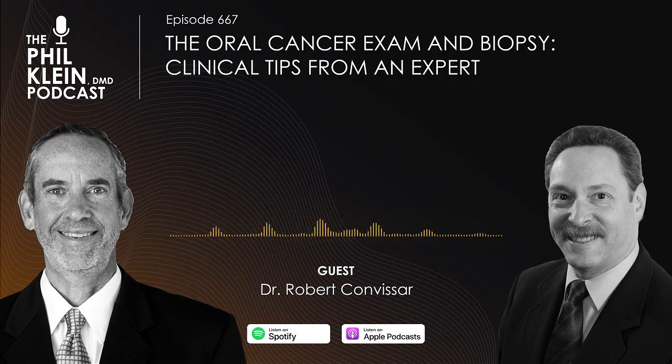As far as special equipment, there is no special equipment. Everything you need to perform a biopsy is in your office. A 15 blade, a needle holder, a pair of scissors to cut the sutures, some sort of suture material, any suture material. You want to use silk, you want to use gut, you want to use nylon, you want to use Vicryl, who cares? Whatever you're comfortable with. Cotton forceps, cotton pliers, and that's basically it.